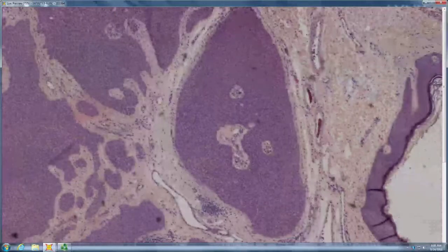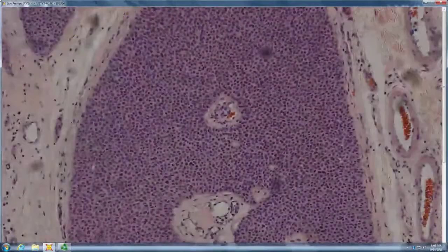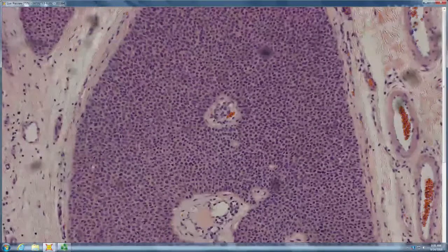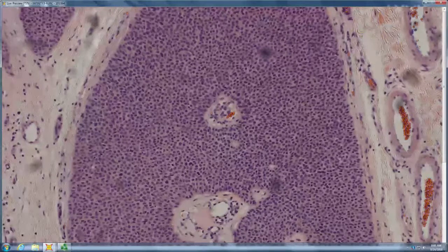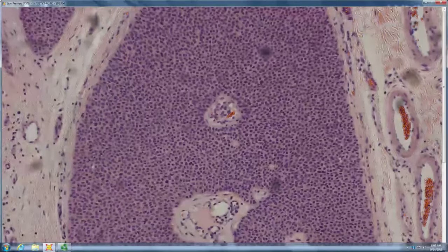It's kind of small, round, monotonous cells. Probably, yeah, something in the acrospiroma group. It's small polygonal cells with cytoplasm. There's no palisading whatsoever. So that's typically going to be somewhere in your acrospiroma, poroma group. You could call that a hydradenoma, you could call it a dermal duct tumor, it's all the same thing. Right?